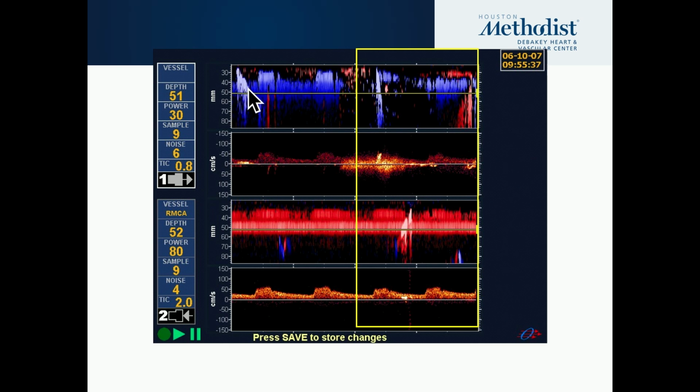Traveling slower. So when a slope is not as steep, you see that this is slow, this is fast. The difference? Traveling in systole, traveling in diastole. Cool? So you see that this is your zero line. In the spectrum it's barely above the zero line, traveling at 10 centimeters per second. Here, in the systolic peak, it's traveling like 50 centimeters per second. So these are the cool differences.